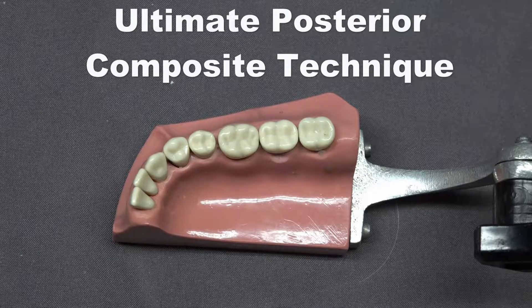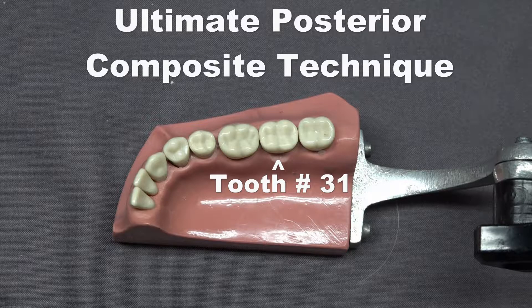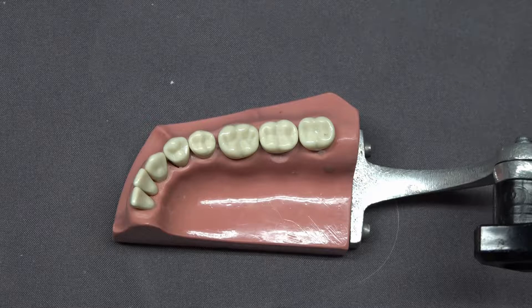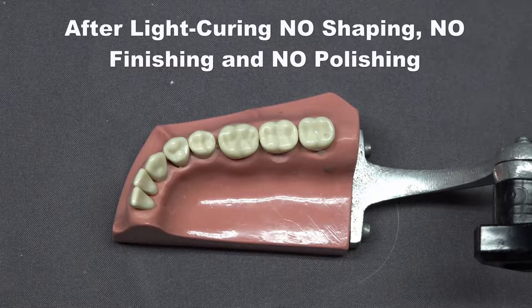We're going to place a DO composite in tooth number 31 using the custom matrix technique with the foolproof separator. This will allow you to create unbelievably lifelike anatomy while doing it very easily and simply.